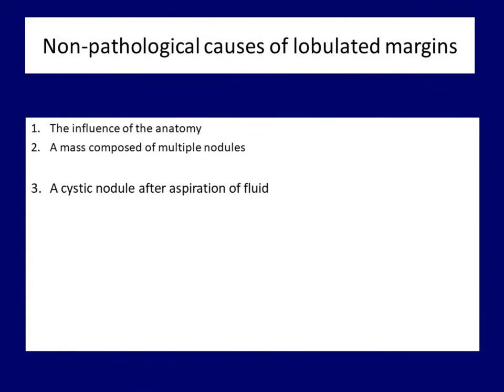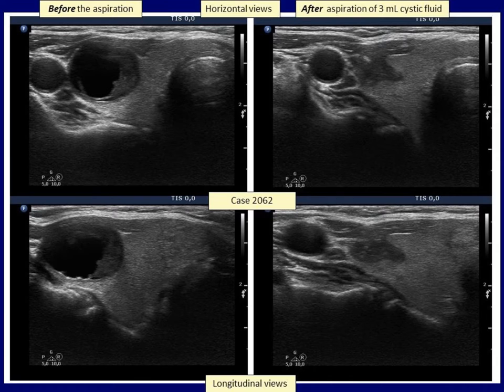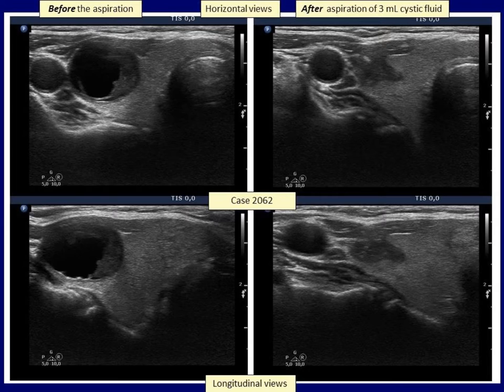A very instructive non-pathological form can be seen after the aspiration of cystic fluid. This mixed nodule had regular borders before the aspiration. However, the borders became clearly irregular after the aspiration of 3 ml of cystic content. This should not cause a problem just after the aspiration. But what if this cyst will not recur and we meet the patient years later with this ultrasound presentation? In order to protect the colleague and the patient from further unnecessary worry, it is worth noting the change in the shape of the nodule on the ultrasound report.